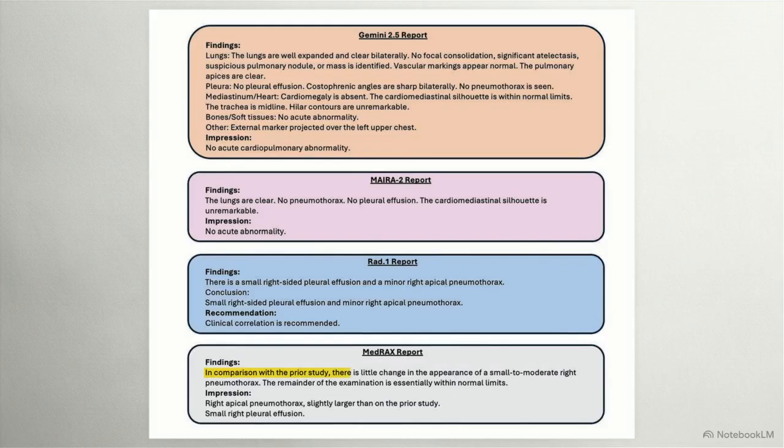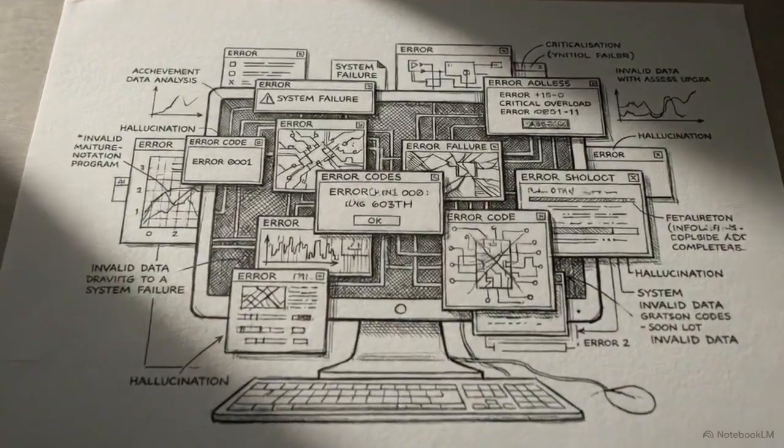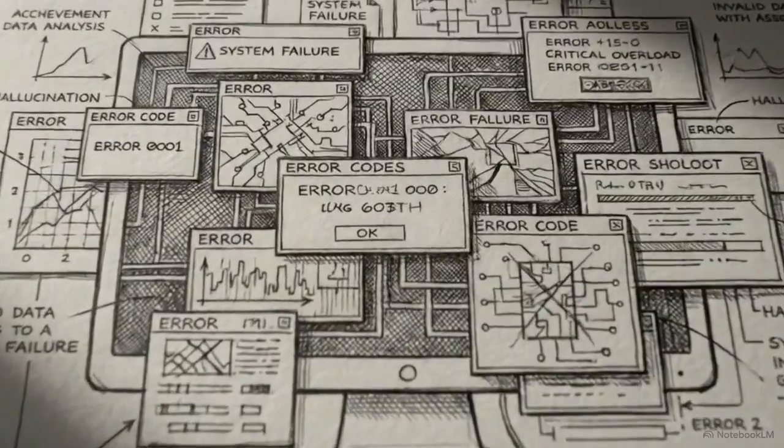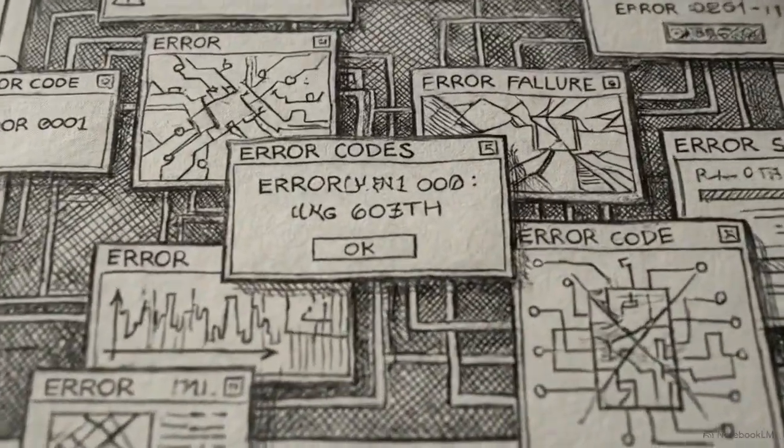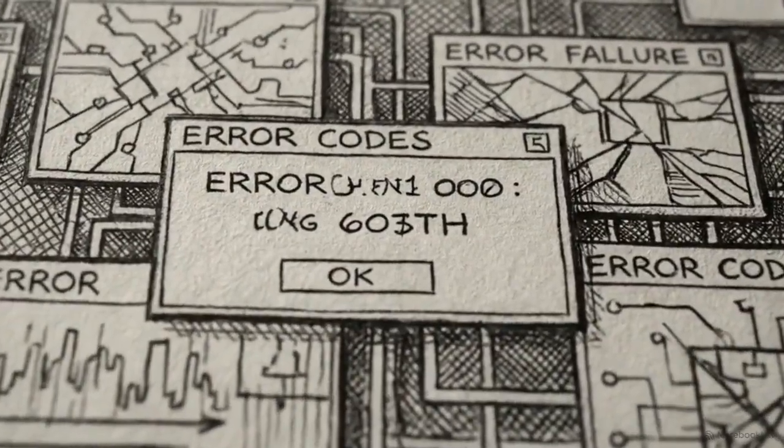The MedRAX report for this image begins by referencing a comparison with the prior study. The model was provided with no prior studies. It confidently invented a past exam to justify its interpretation. An advanced agentic framework does not inherently ensure reliability. If the internal component tools are poorly calibrated, the system will confidently invent clinical history.